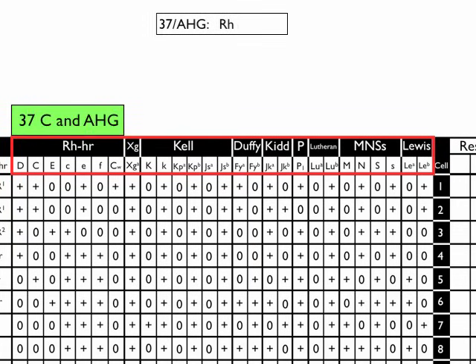They tend to react not only at the anti-human globulin phase, but they will also, on liquid panels obviously, react very commonly at 37 degrees. That's a little unusual. Most so-called warm antibodies, those that react best at the anti-human globulin phase, don't necessarily have 37-degree activity. So if you see 37-degree activity without immediate spin activity, you really should be thinking of the possibility of something in the Rh system.